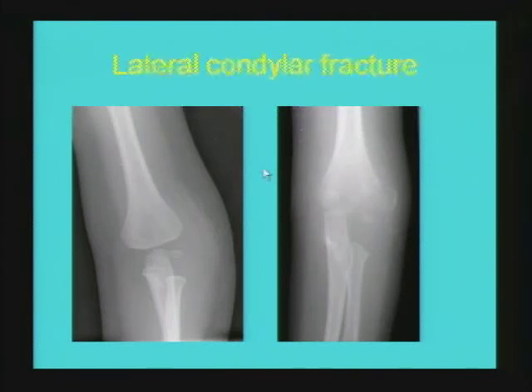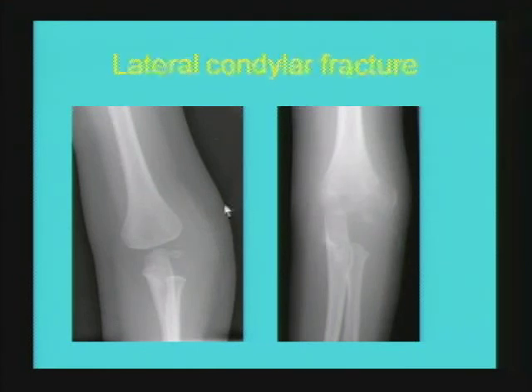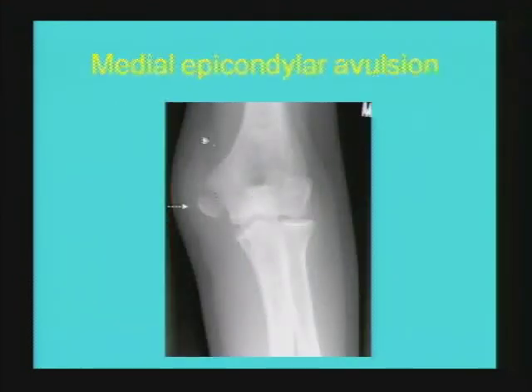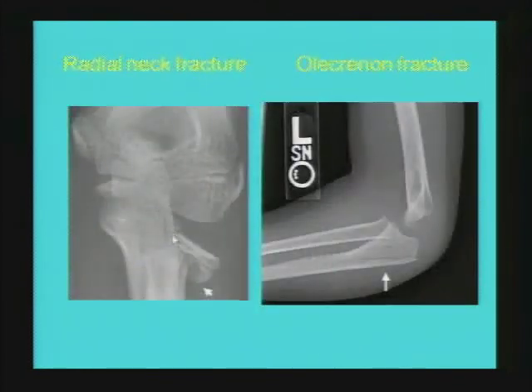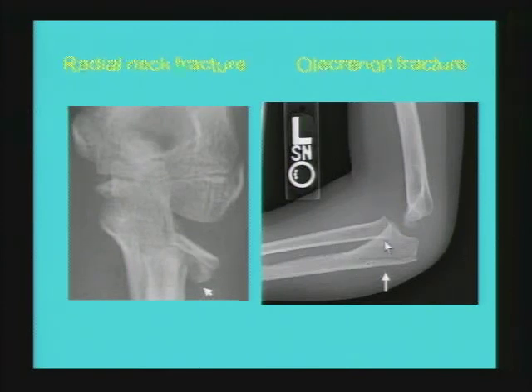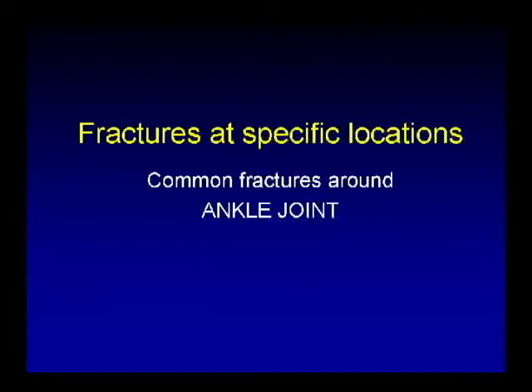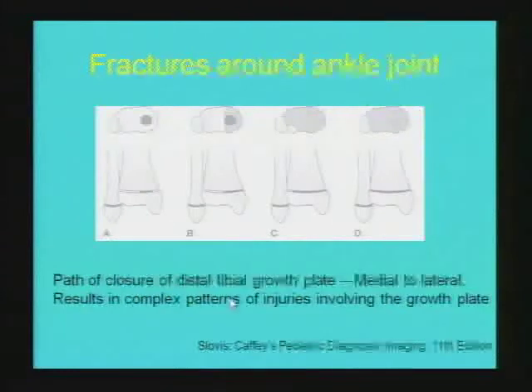Lateral condylar fracture can be subtle, as in this case — soft tissue swelling, with a sliver of bone better appreciated on the oblique projection showing a displaced lateral condylar fracture. Example of medial epicondylar avulsion: soft tissue swelling overlying the medial elbow with displacement of the medial epicondylar ossification center. Example of displaced radial neck fracture. Example of non-displaced olecranon fracture.